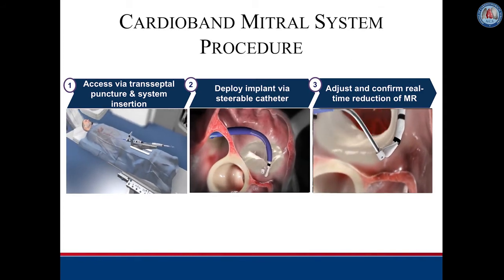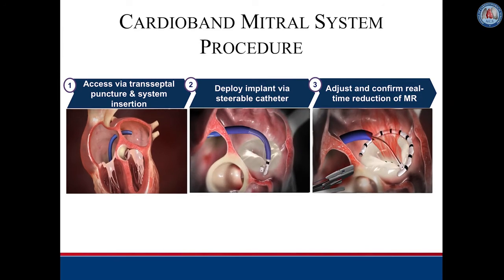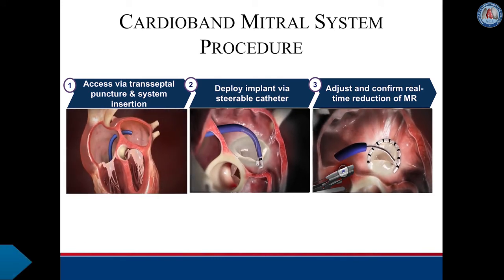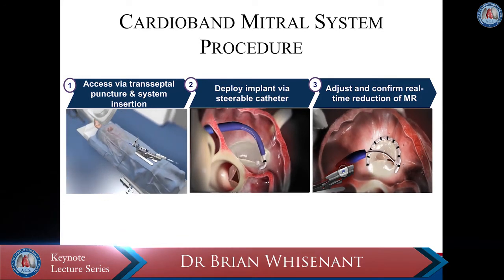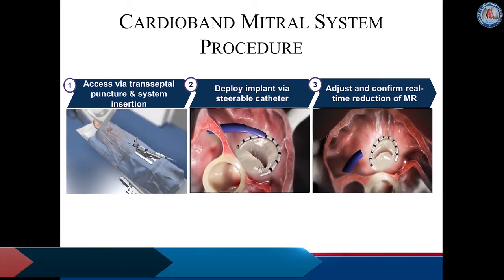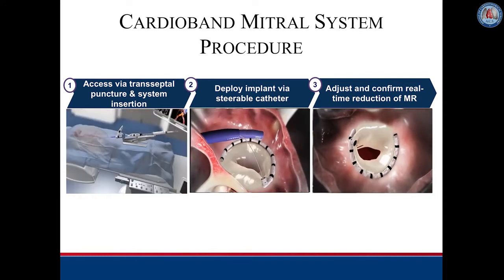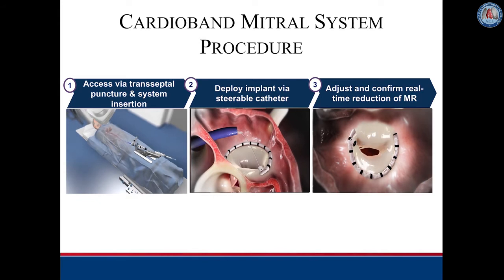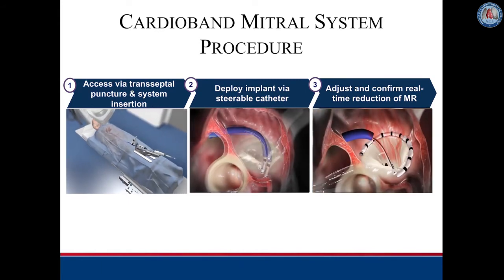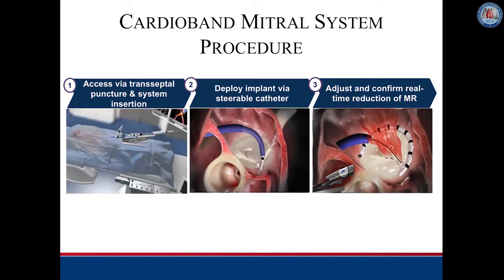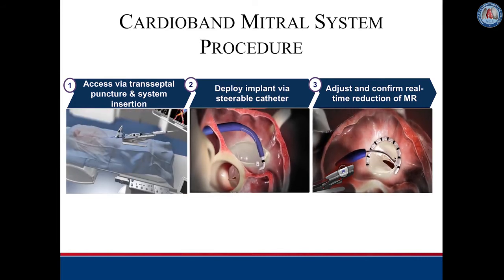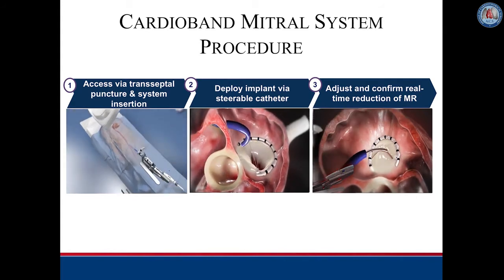These three animations demonstrate the Cardioband procedure. The procedure is performed via the femoral vein and transseptal access to the left atrium under 3D transesophageal echo guidance. The catheter is then steered to the anterolateral trigone where two anchors are passed through the Cardioband into the fibrous tissue, anchoring the distal end of the band. Transesophageal echo is used to identify the hinge point of the annulus. The Cardioband and catheter delivery system are then navigated posteriorly around the annulus until the medial trigone is reached, where final anchors are positioned.